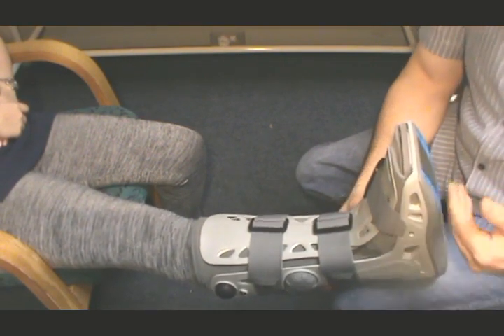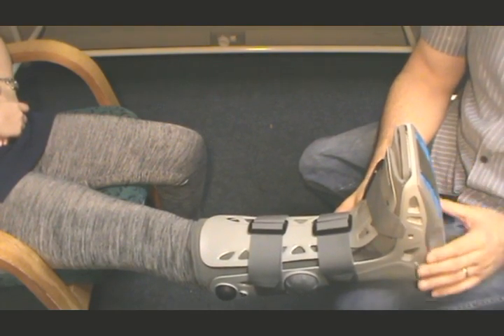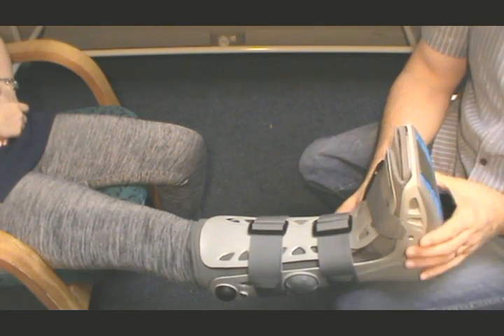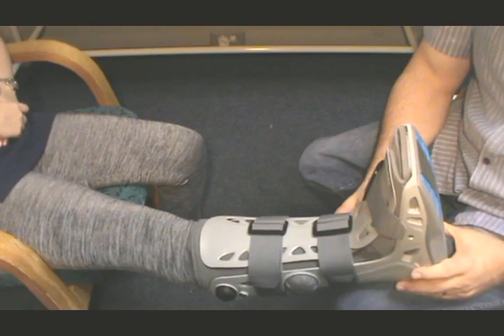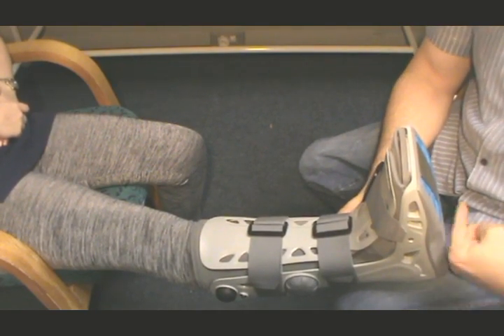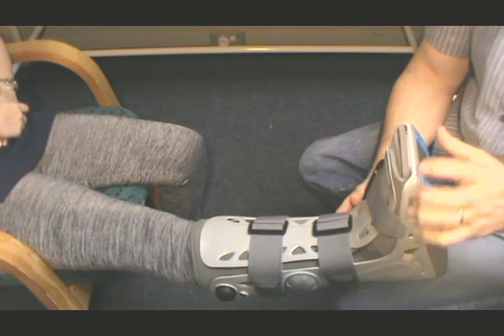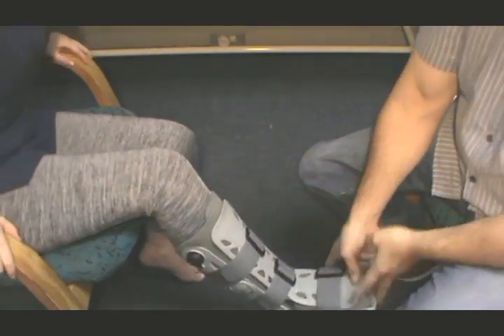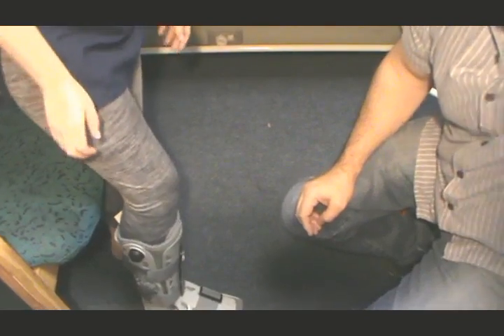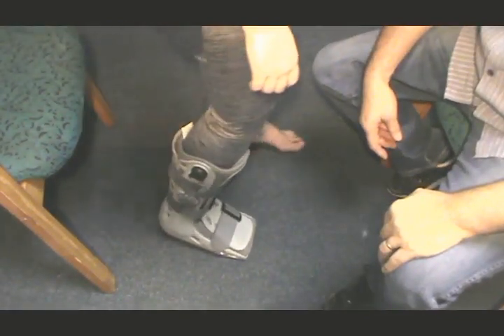Just also remember that the boot has got a rocker bottom with a non-slip surface. But although it's non-slip, please be careful of any slippery surfaces. There's nothing that is completely non-slip. But you can see it's got a rocker bottom, so you're going to strike with your heel and then rock over the foot onto the toe. So let's just quickly demonstrate that. Amy, you can just demonstrate how to rock on the boot.